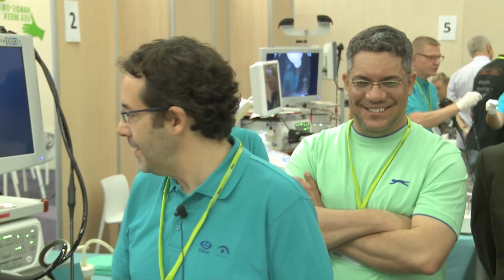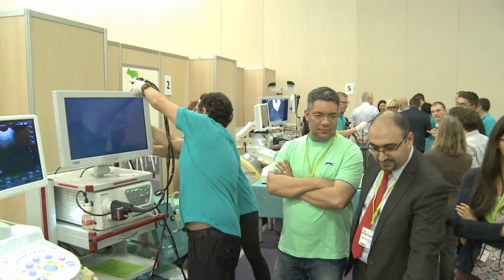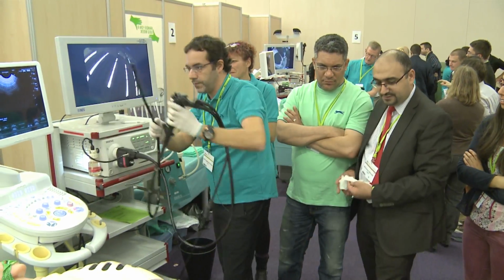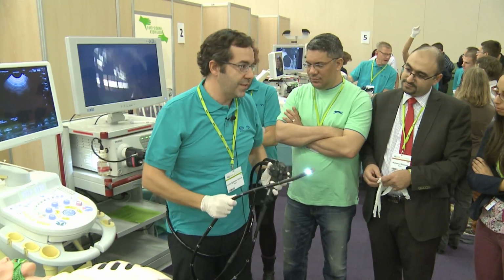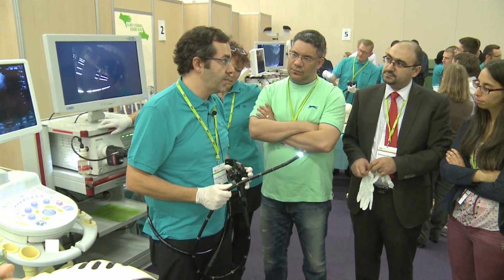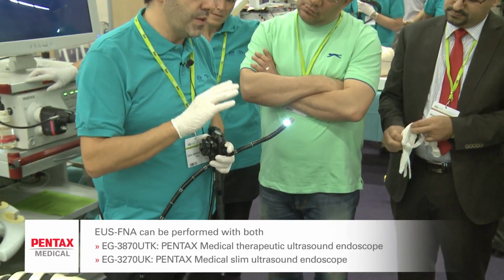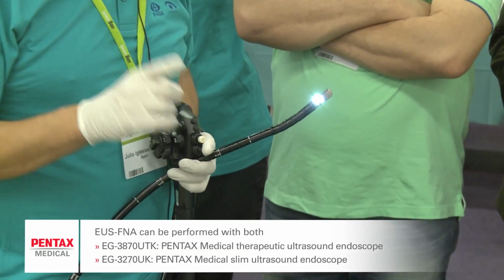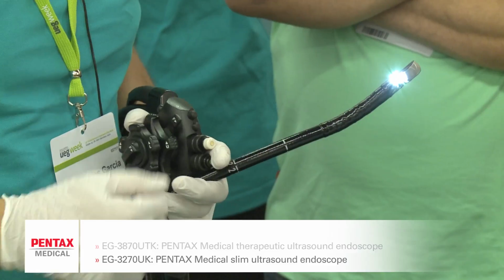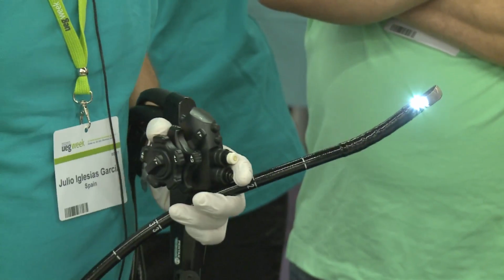Okay. So first we will take the scope. Okay. So we will use the 38. This is a therapeutic scope. You know that PENTAX has two different scopes, the therapeutic one and the slim one. You can perform all kinds of FNAs with both scopes except the new 320 from Cook, which only goes through the biggest working channel of the 38. So it's okay because we are going to work with the 38. Okay?